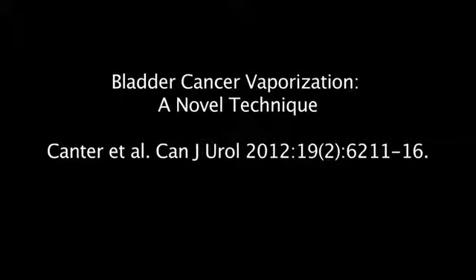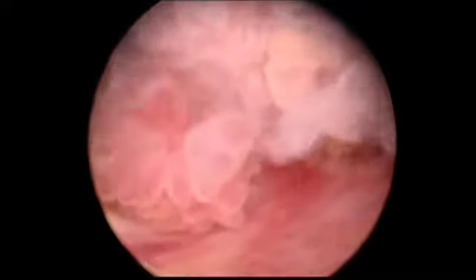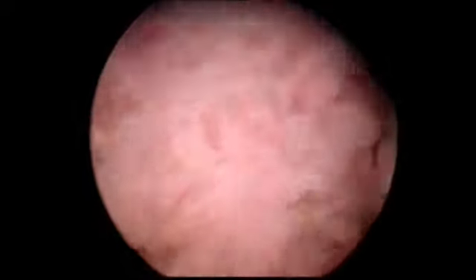This is a 73-year-old lady who was referred for independent assessment and recommendations regarding her newly diagnosed bladder cancer. The patient has the expected comorbidities of a lady in her 70s. This is her first diagnosis of bladder cancer. She was deemed by her outside urologist to have unresectable disease.